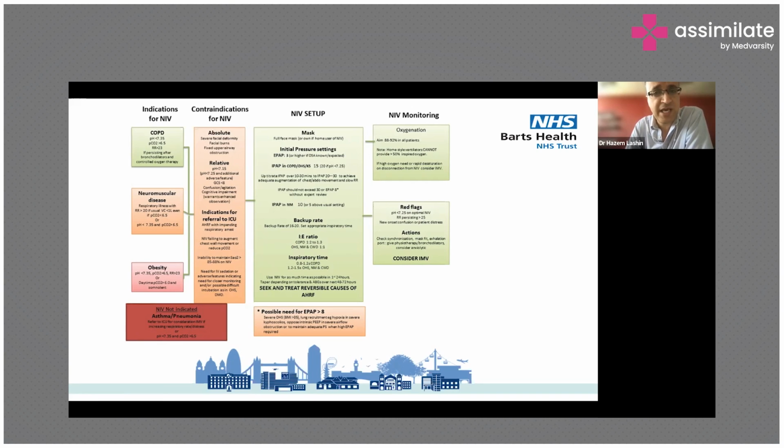Absolute contraindications are facial problems, such as facial deformities, burns, or fixed upper airway obstruction.